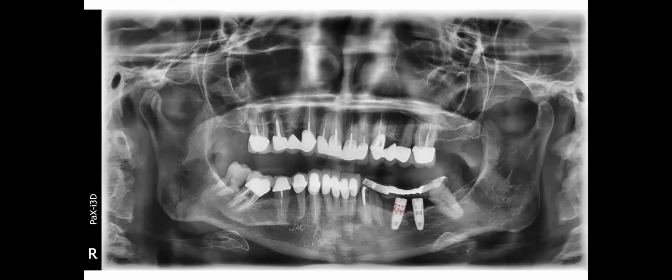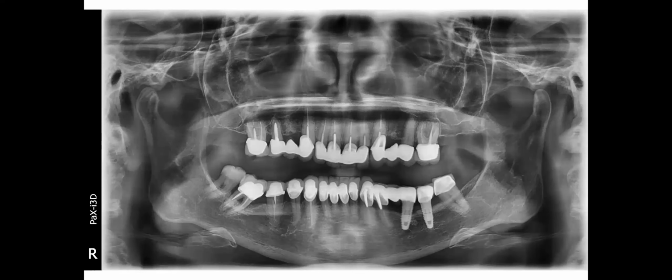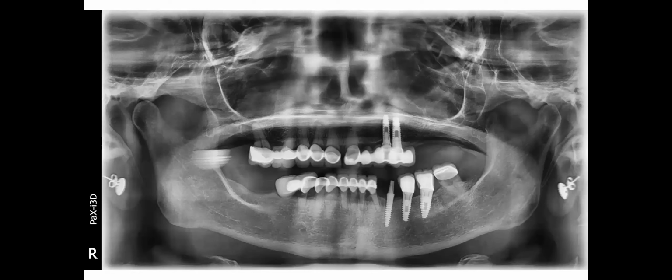This is another case. We have lower left area. And these are, again, our tissue level implants. And here are some more. And again, this one here, I believe, is 3 to 5 years later on the same patient.